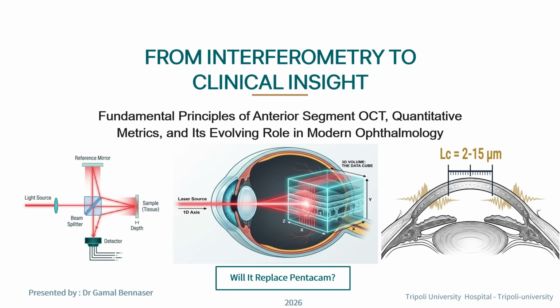The aim is to explore, highlight and share with you some of the important information regarding this newly emerging technology that is bridging the gap between the clinical examination and the histopathology. As you know, the optical coherence tomography, also known as the optical sectioning of the eye, because we can see the ultra structures of the eye based on this technology.